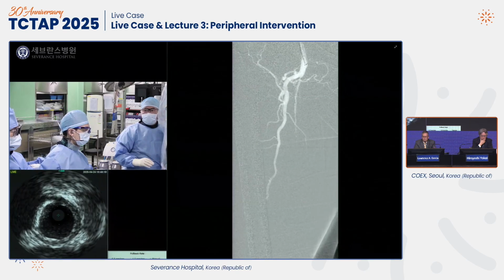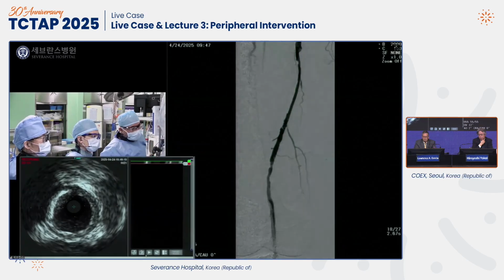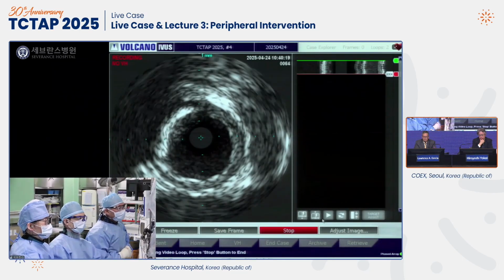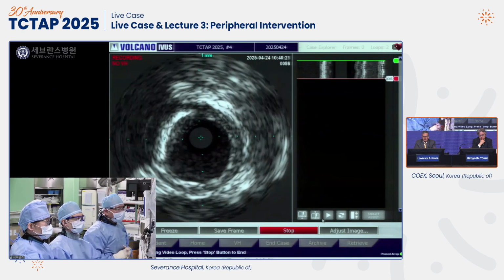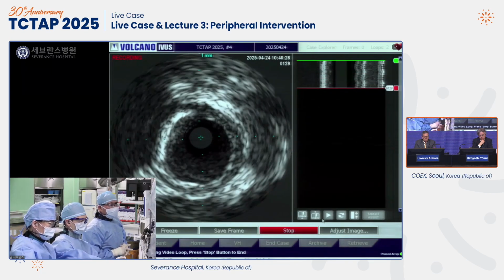Dr. Ko, do you have IVUS? Yes. And Dr. Ko, as you taught me, do you want to talk about your JetStream process? You do blades down, blades up, but then you also flush between cuts, correct? Yes, right. That's one of the great teaching points.